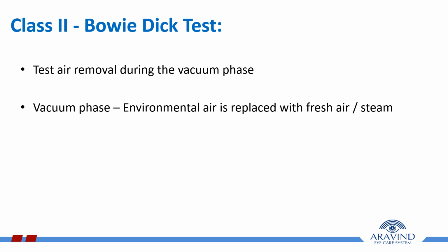Class 2 is Bowie-Dick test. This test is performed to check air removal during the vacuum phase of the steam sterilization cycle. During the vacuum phase, the environmental air is replaced with fresh air, that is steam, in the chamber.